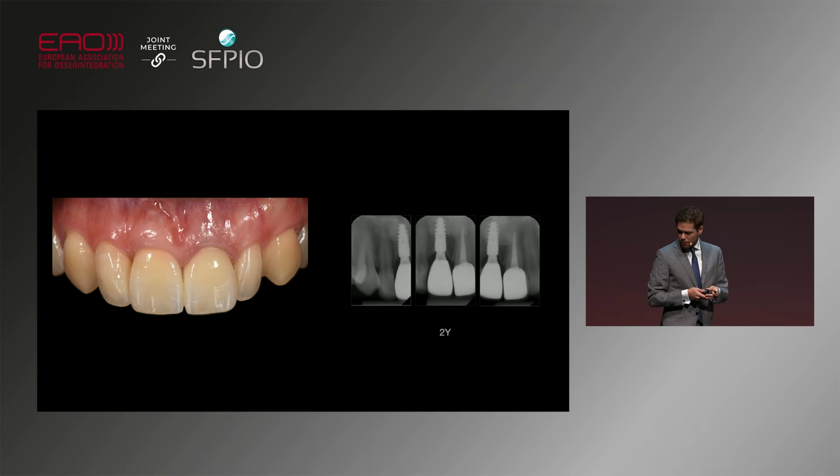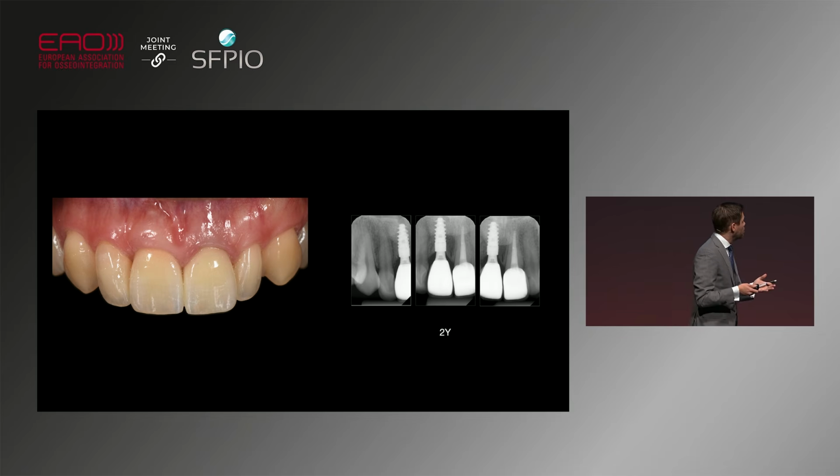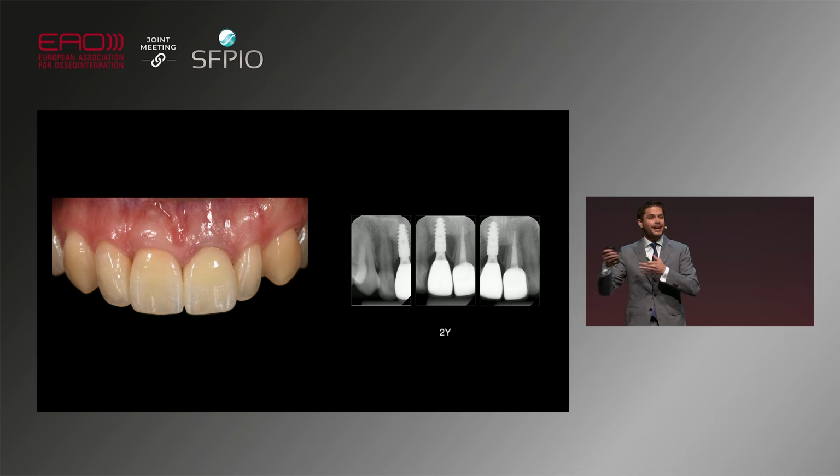So here's the follow-up 2 years after, with stable results, and once again transforming a case that could have been complex with extensive bone augmentation into something that I would say is relatively simple.